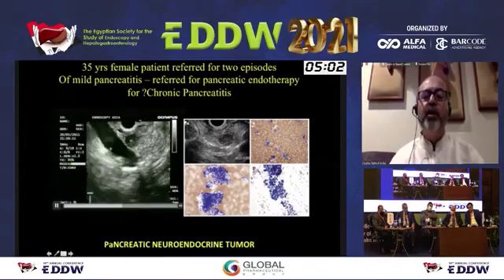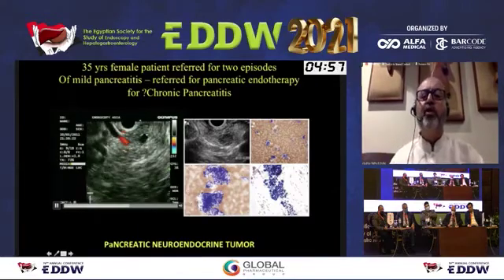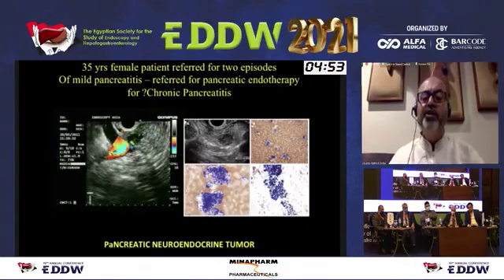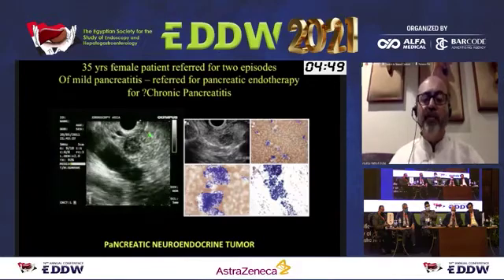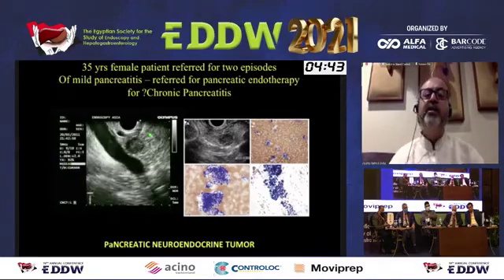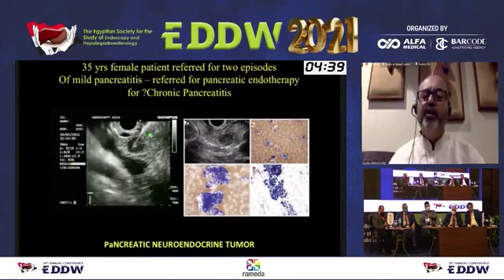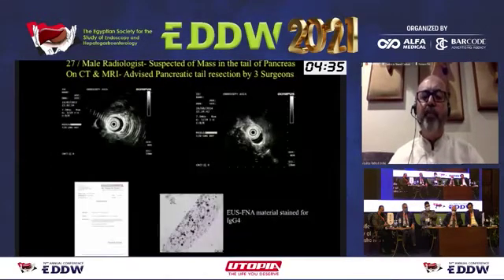And this is the entire pancreatic body. And you can see I'm doing EUS FNA. Now, just for the information of our youngsters here, endosonographers, if a lesion is resectable and if your surgeon does not want an FNA, he is absolutely right. You just leave it alone and that can be resected. So if there is a resectable lesion, we also do not do FNA by and large if this patient is going for surgery.